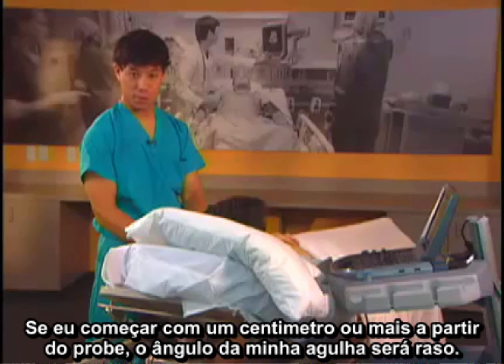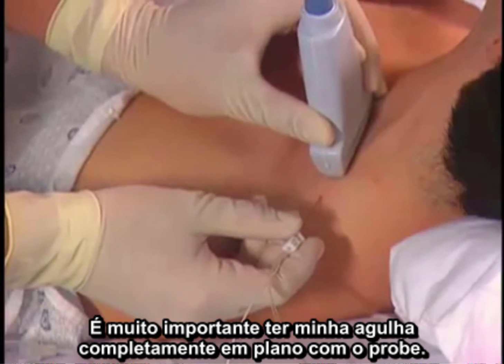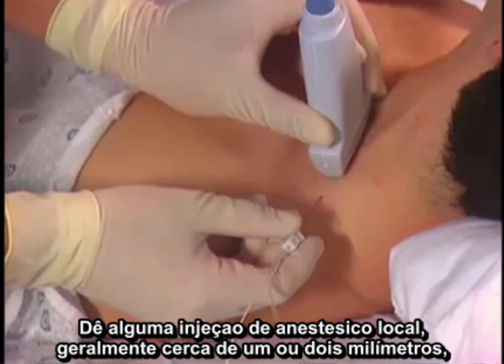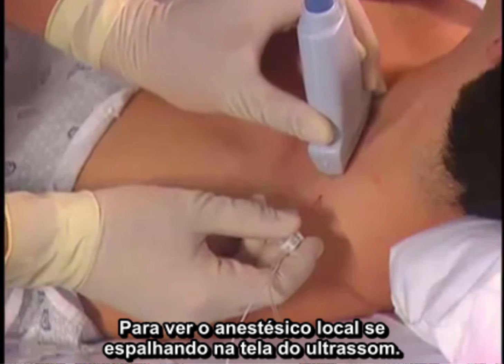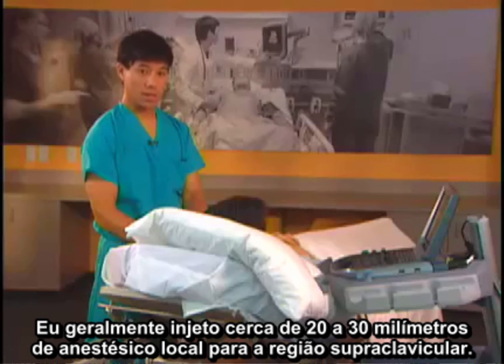If I start a centimeter or more away from the probe, my needle angle will be flat and it will be visualized better on the ultrasound machine. It's very important to have my needle completely in-plane with the ultrasound probe so it will be visualized during its entire length. I give about one to two milliliters of local anesthetic to see the spread on the ultrasound screen. Injections below the nerves will push the rest of the brachial plexus more shallow, making the rest of the block easier. I usually inject about 20 to 30 milliliters of local anesthetic in the supraclavicular region.